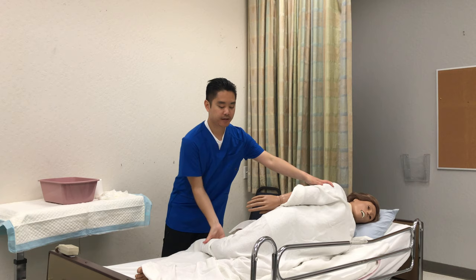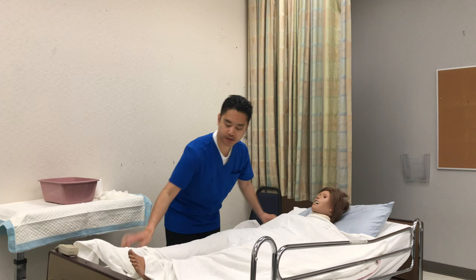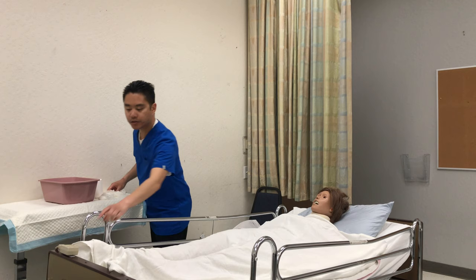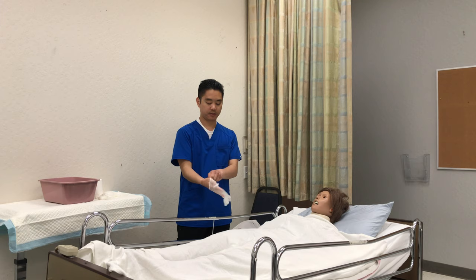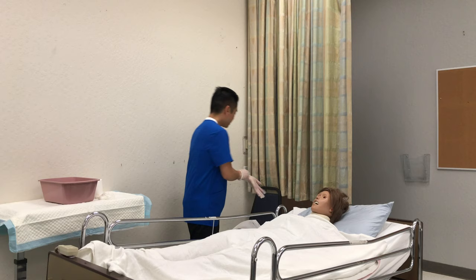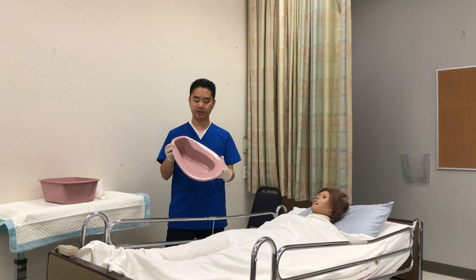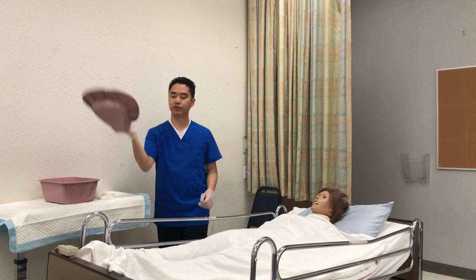Mrs. Smith, we're gonna lay back down on the count of three: one, two, three. How do you feel? I'm gonna raise the side rail and lower the bed. My next set of gloves will be to clean the bedpan — I can throw away the cover. I'm going to check the bowel movement for any abnormalities; nothing's wrong, so I'll dump it into the toilet, rinse it, and dry it — this goes to their personal belongings.